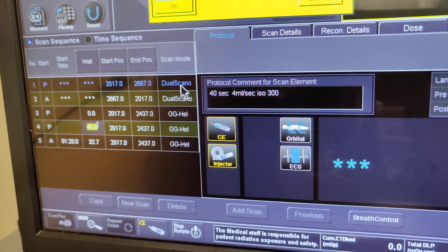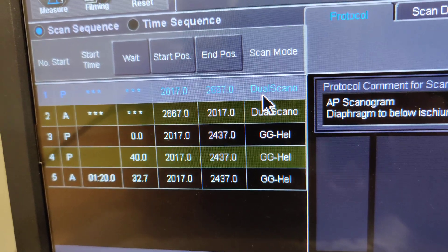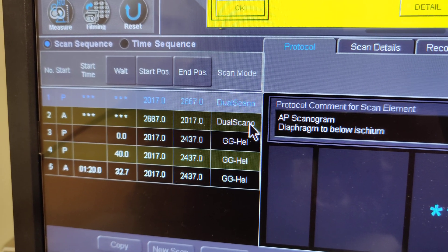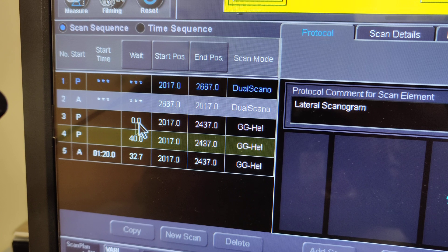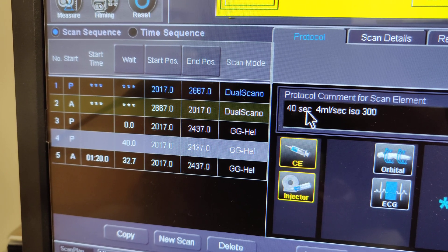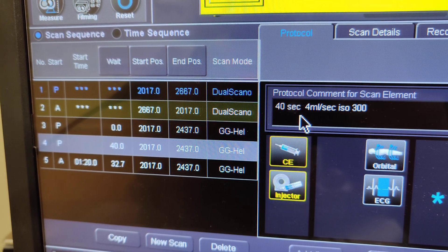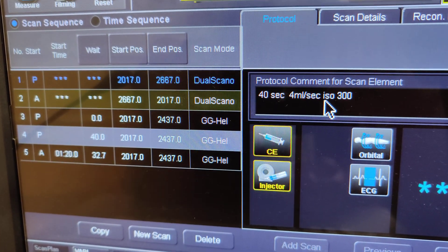Here on the scanner, the protocol for a pancreatic protocol — they normally order it with and without, but without and with. The first one here is your first topogram or scanogram or scout, the AP view. The second is your lateral scout view. The third is your non-contrast. Then your second one is your arterial phase, so it's a lot faster. We're not going to trigger off of anything — it's just going to be an automatic 40-second delay. Since it's an arterial phase, we're going to go in at 4 milliliters per second, and we're going to use IsoView 300.